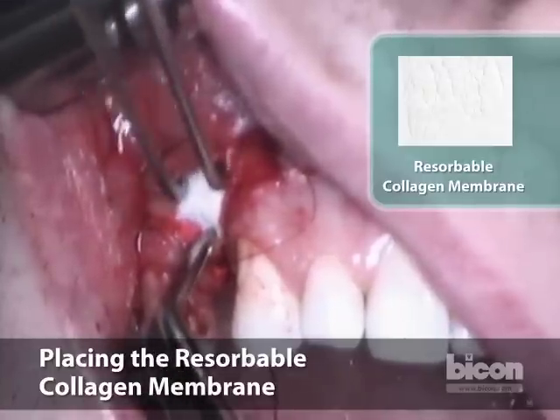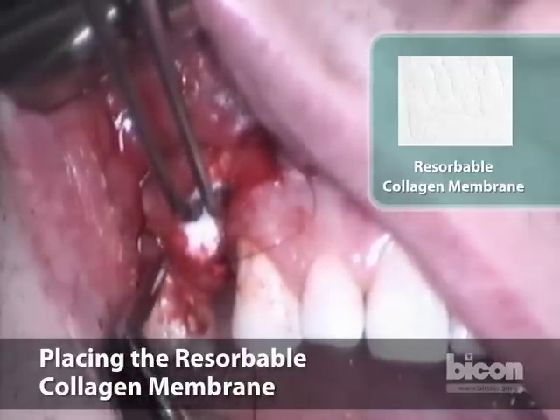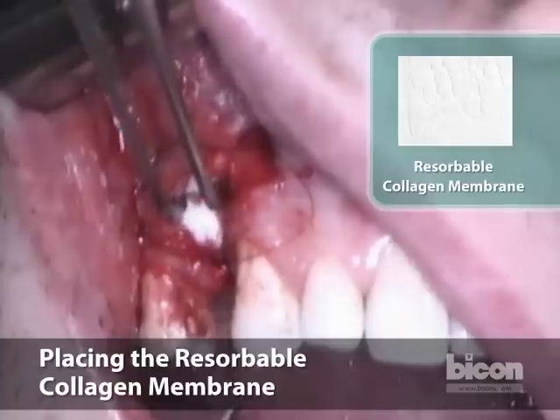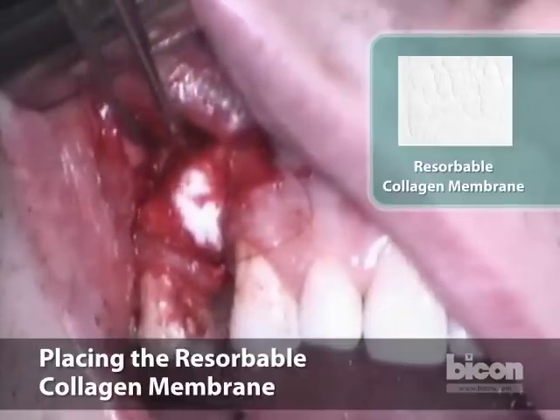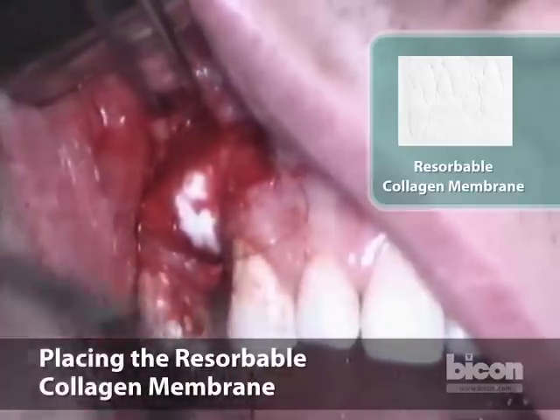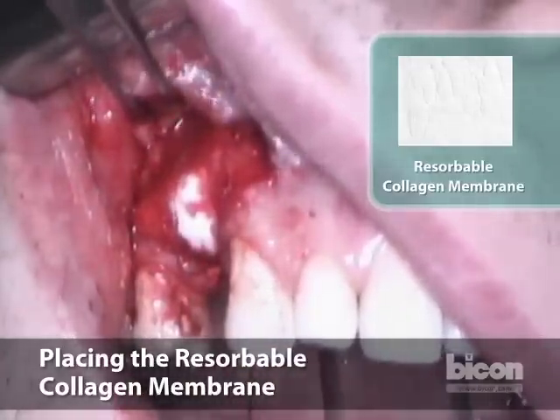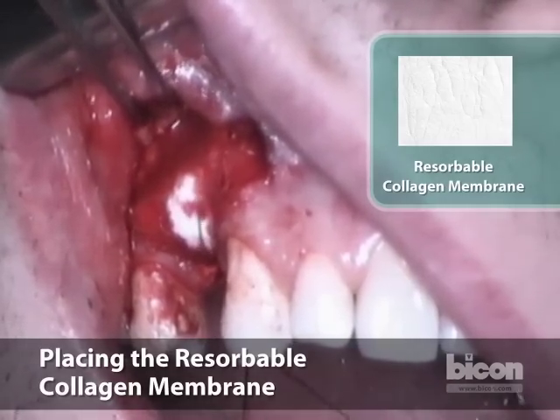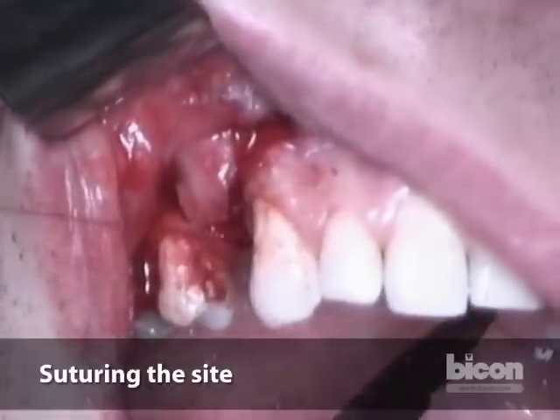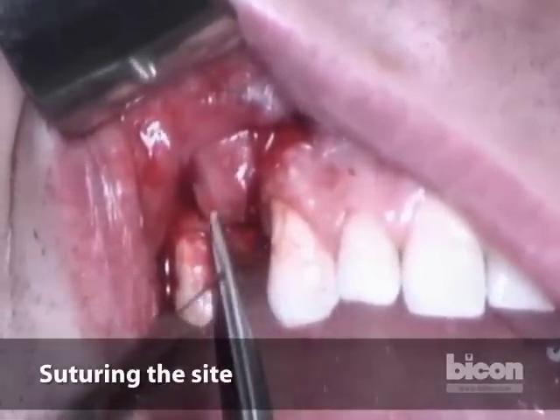What I want to do is keep the head of this. Once we get one of them, I will reposition that. It's the tedious part of the whole process — this step — but it is crucial to be patient and do it properly, otherwise all of the work will go to waste. The graft and the membrane are now secure, and that basically is the whole purpose of this exercise.